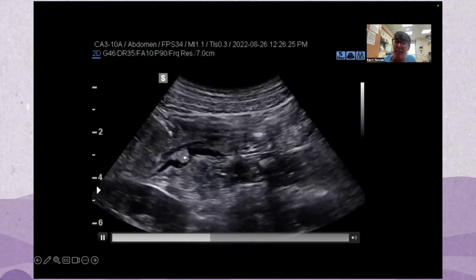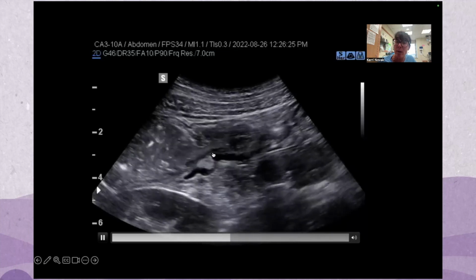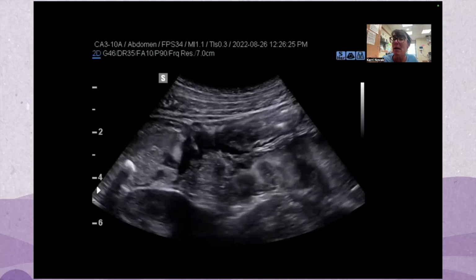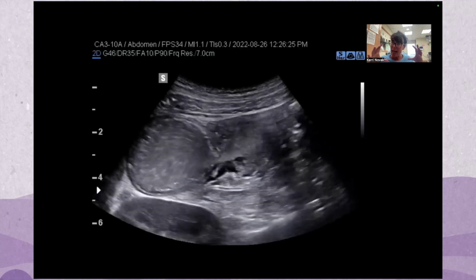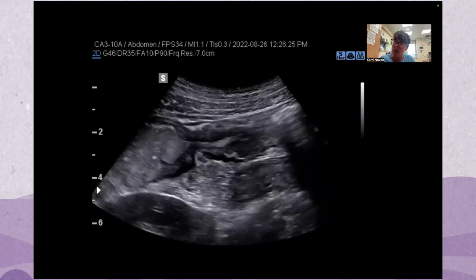Here we see a stricture. So here you see thickened bowel with the different layers. You see the different stripes, black, white, black, and you see contents shooting through these two areas that are about maybe an inch long, where the lumen is narrowed and contents are having to shoot through. Behind it, the bowel is dilated, working very hard to get the contents through.